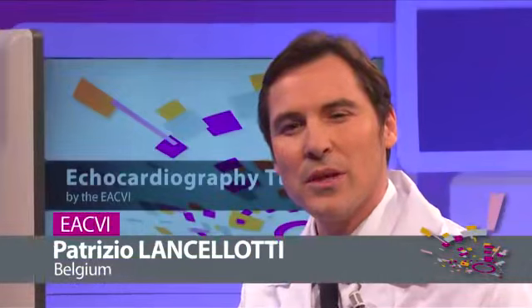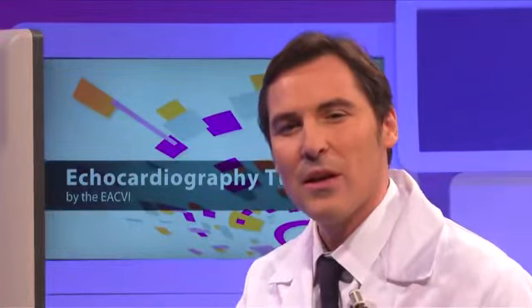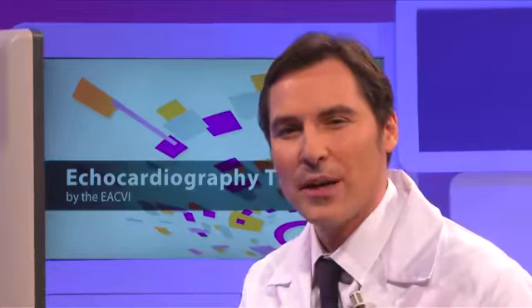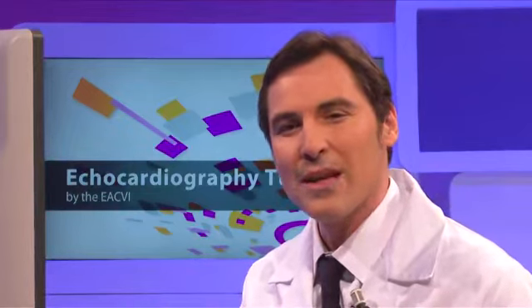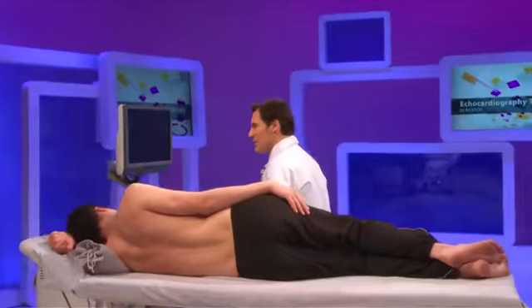So during the next few minutes, I will show you the key features that should be recorded in a patient with primary mitral regurgitation related to degenerative mitral regurg. So we will start first by assessing the mitral valve morphology. After that, we will evaluate the severity of the mitral regurg, and finally, we will assess the consequences of the mitral regurg on the left ventricle.